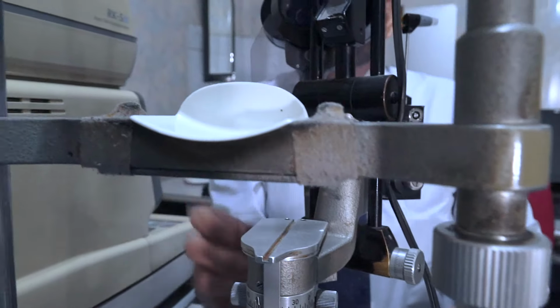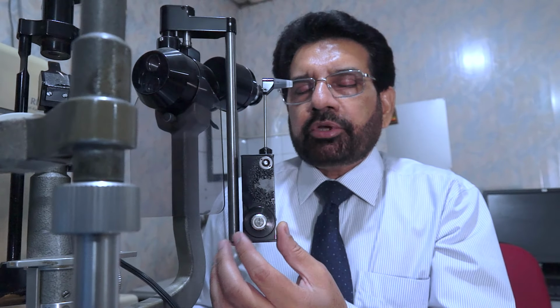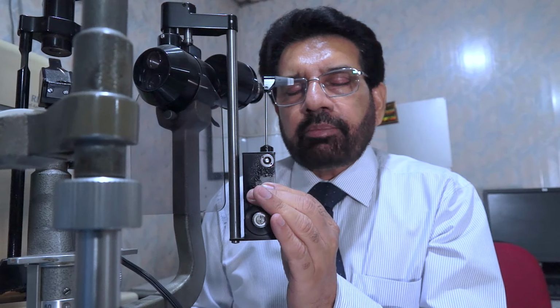Then this is the neutralization point, and that reading can directly be read from this dial over there, which shows the graduations up to 7 or even up to 8. So it can measure and we can read it from there. Each graduation number is equal to 10, so if it is 1, then it is 10 millimeters of mercury, and each small graduation is equal to 2 millimeters. So we can read the intraocular pressure directly from this. This is called the Goldmann applanation tonometer.